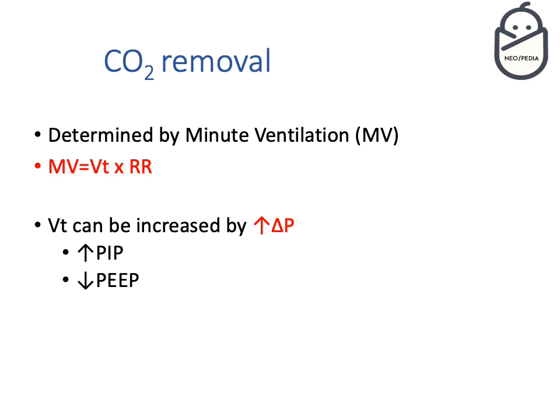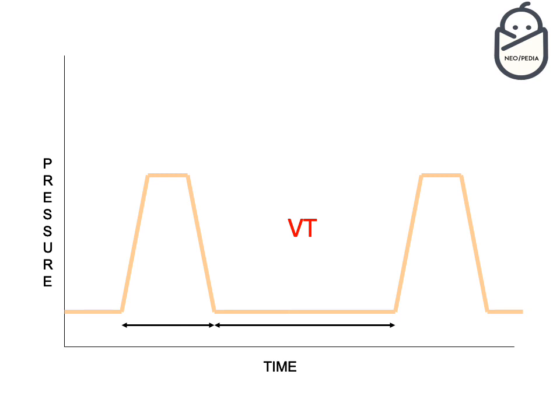And as we see here in this formula, the minute volume is the result of multiplying the ventilator rate and the ventilator tidal volume, which is here.